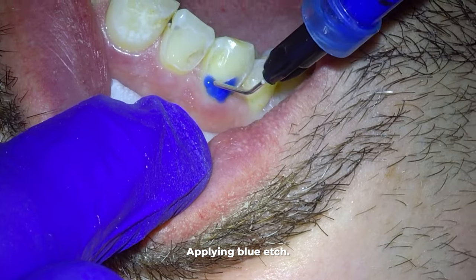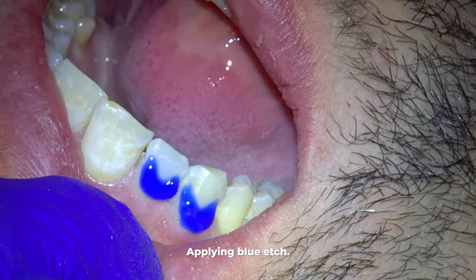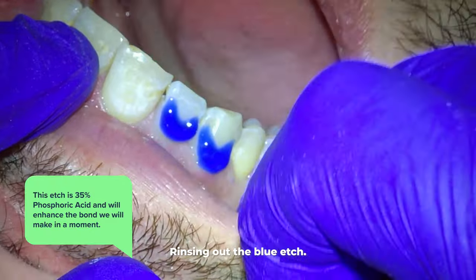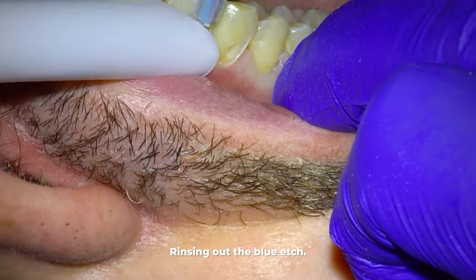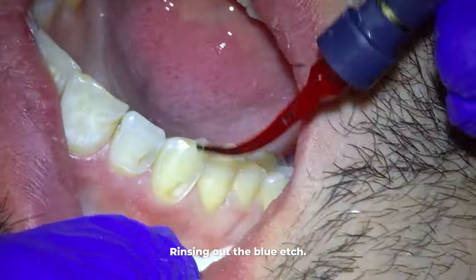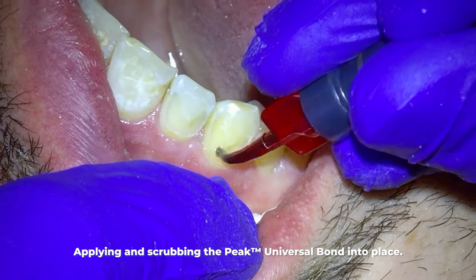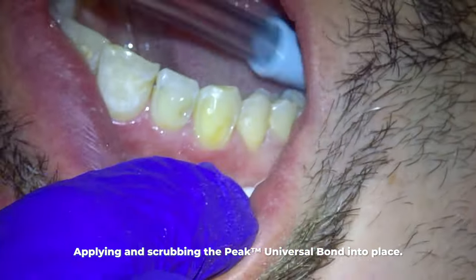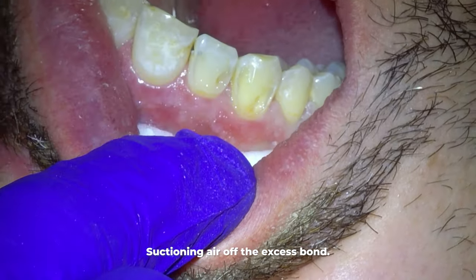We start by etching the slot that we made in the tooth — we dentists call this the prep or filling preparation. The blue etch I'm applying here is 35% phosphoric acid and will enhance the bond we will make in just a moment. We rinse that thoroughly away, and then next we use a bond called Peak Universal Bond. I've personally tested this bond against all the other strong bonds I had considered and found it to be the strongest. I scrub the bond into place to help the filling bond better to the tooth, then suction and air off the excess bond, and this intense light cures or sets the bond into place.